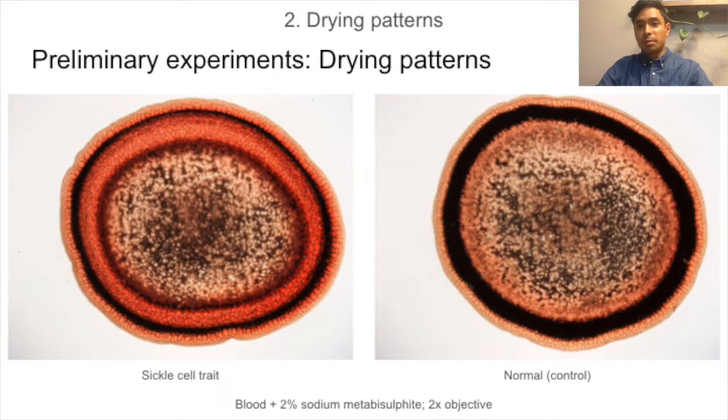Moving on from microscopic imaging to macroscopic imaging, we looked at drying patterns of blood. In this experiment, the mixture of blood plus reagent was placed on a microscope slide and dried under ambient conditions. The preliminary results were quite exciting.